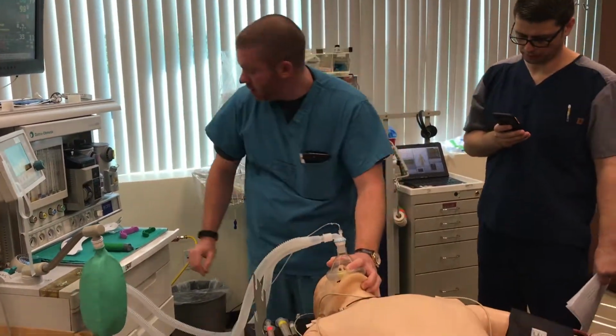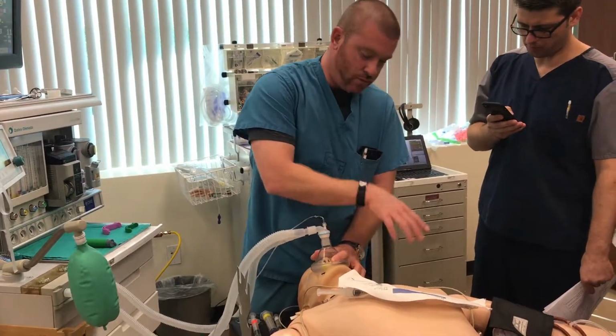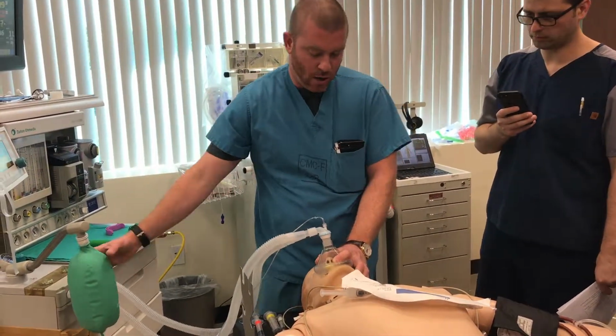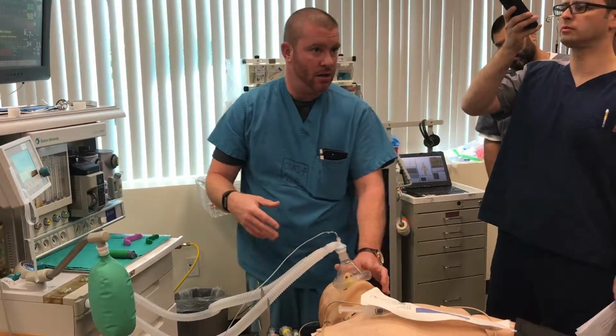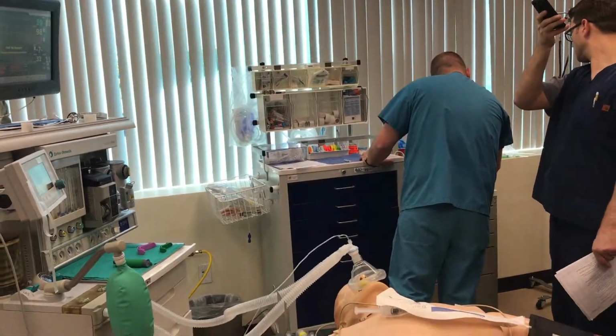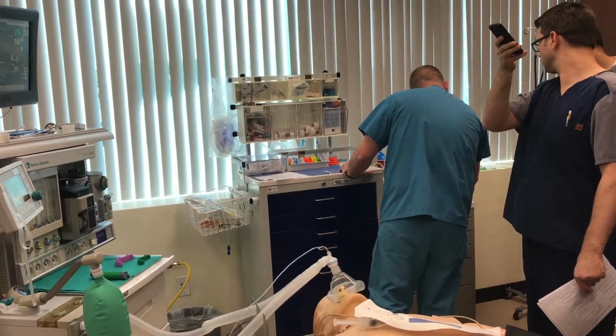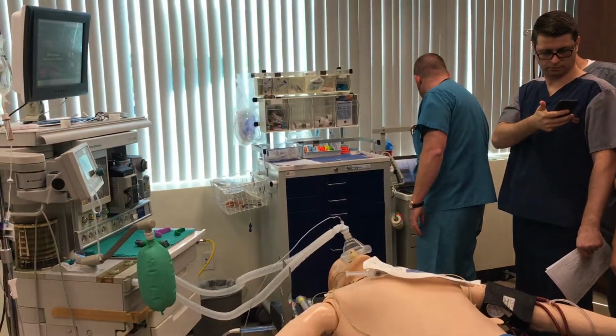Good. Notice my laryngoscope, my ET tube is right here, waiting for fasciculation. So I would be ventilating him, right, as I'm waiting for fasciculation. Here's what your fasciculations will look like. He's now fasciculating.